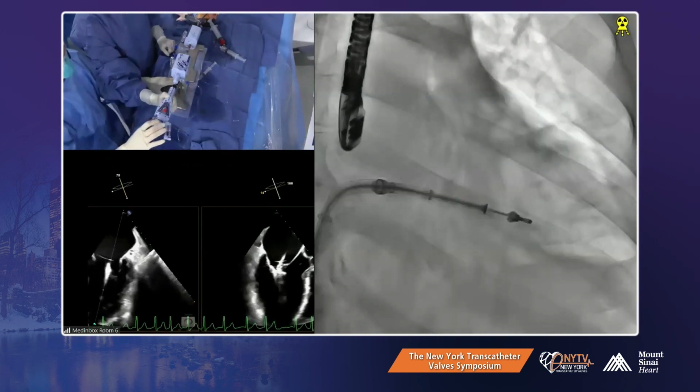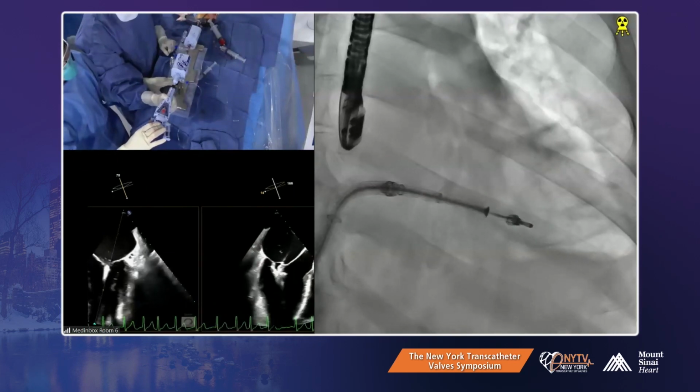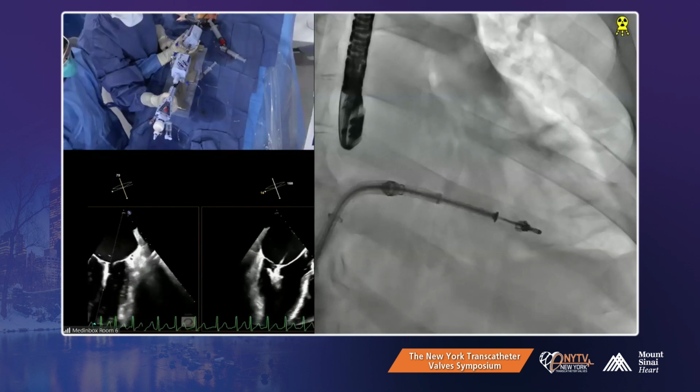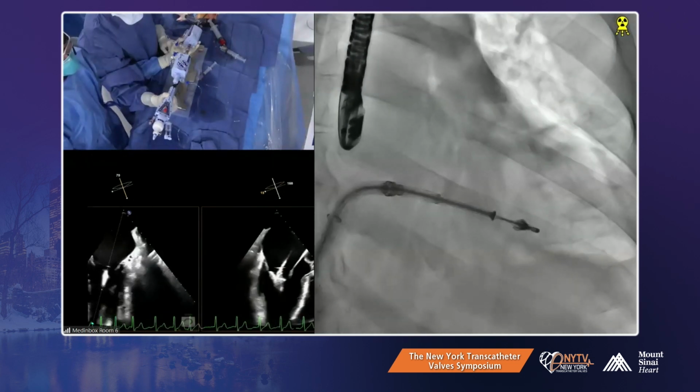Do you want to go lateral first and then come back to that? At this point, no. Because it's very biased. Well, look, it looks like, again, with the length of these graspers, you may need to go central. Yeah, we're going quite central now on the bicomissural view, right?